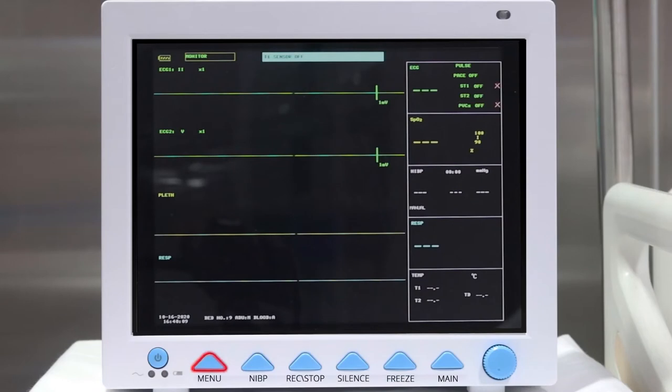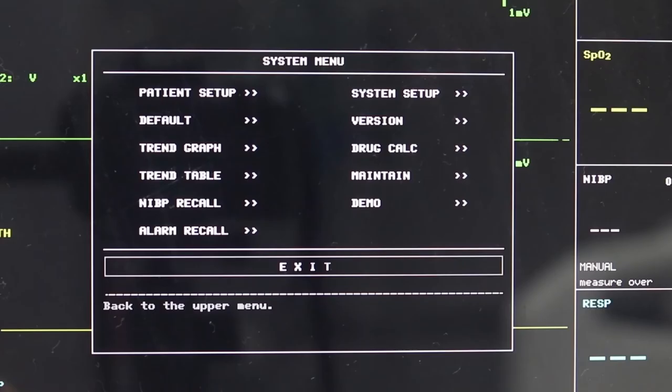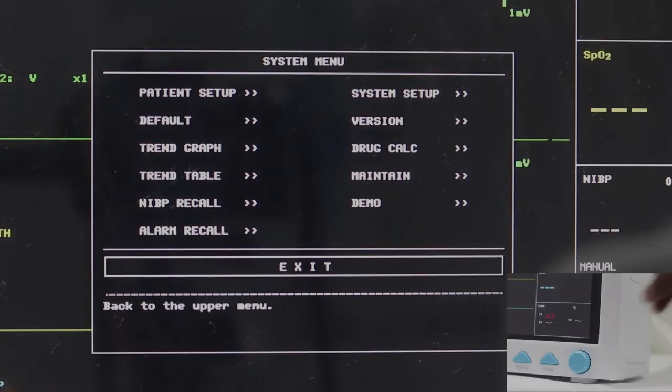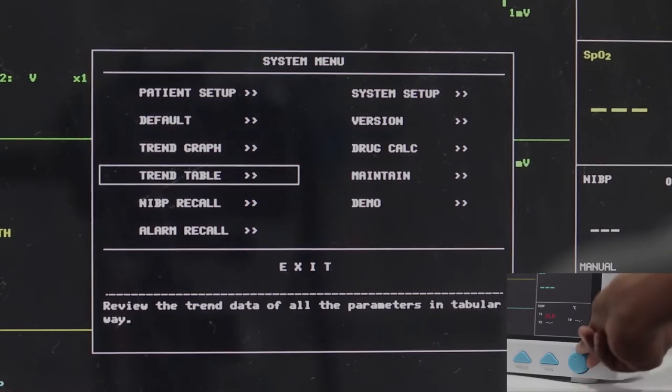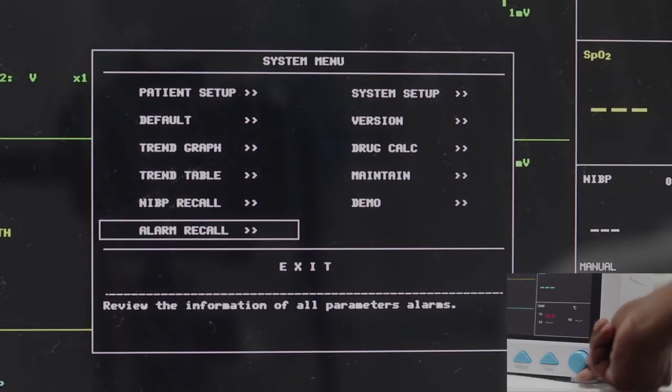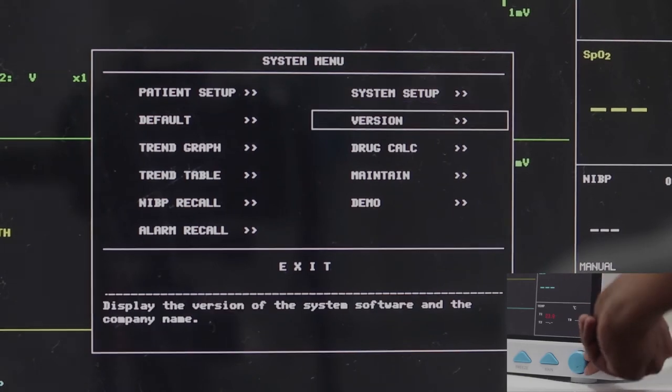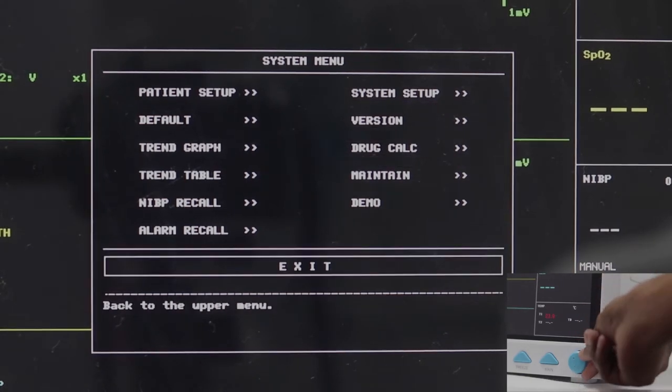Menu: Press the menu button on the front panel of the monitor to call up the system menu. Use the rotary knob to navigate through the options. It can be rotated clockwise or anti-clockwise. To select or realize an option, press the knob.